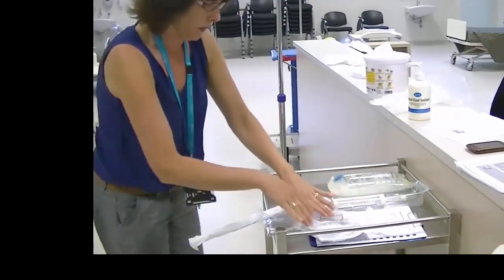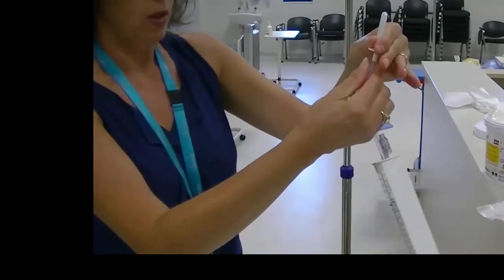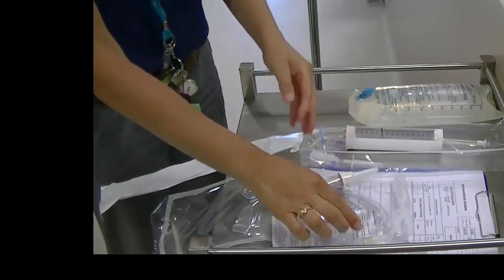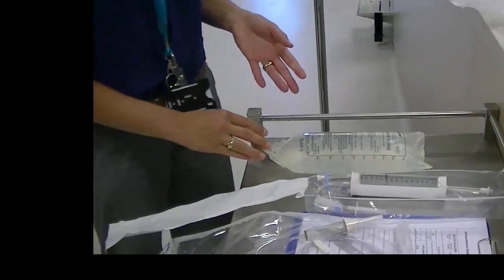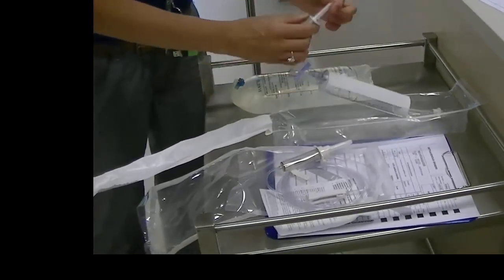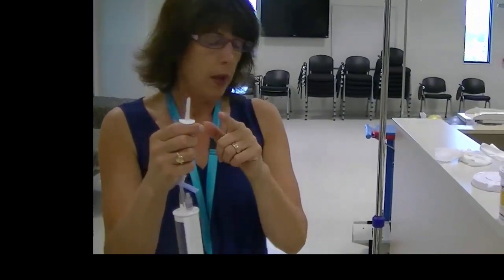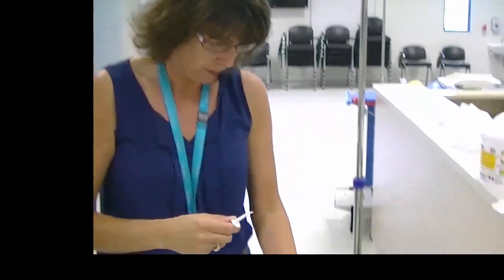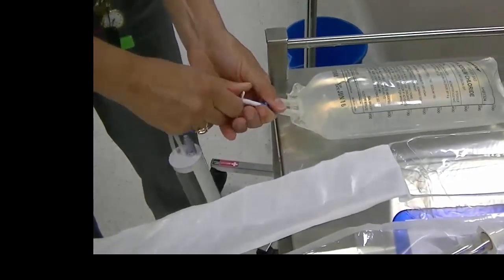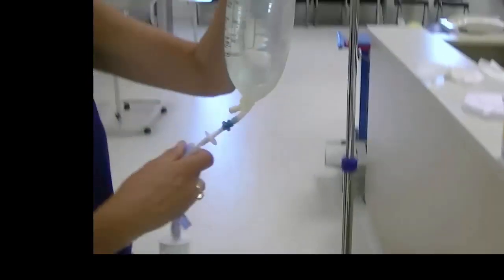The first thing I'm going to do is make sure all my roller clamps are off. I will start by connecting the flask to the burette. So you twist the cap off. Do not touch anything that had a cap on it prior. That would be contaminating it. And be very careful puncturing the flask. You don't want to go through the side of it and end up puncturing yourself. Okay, I will hang that now.